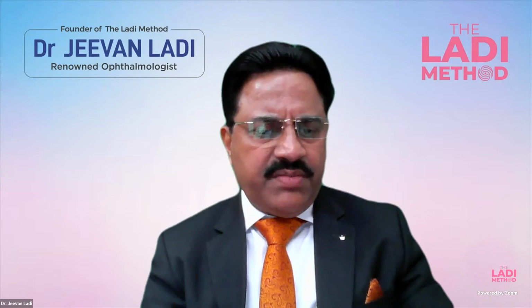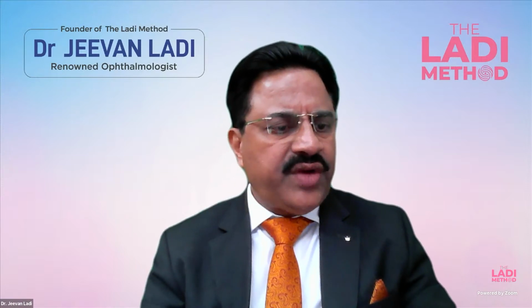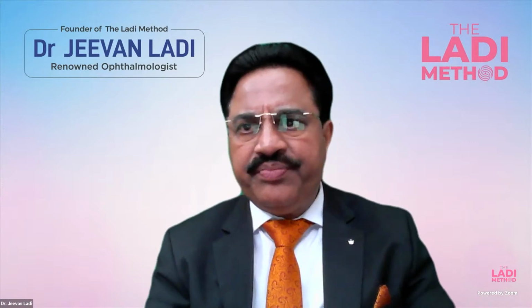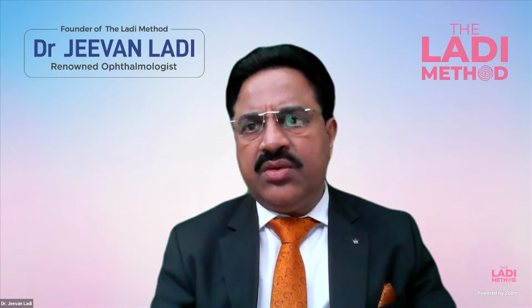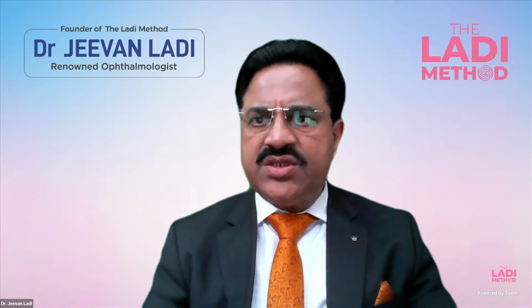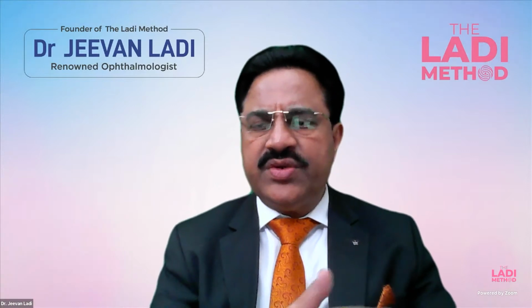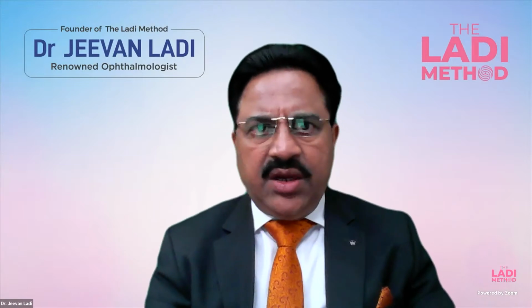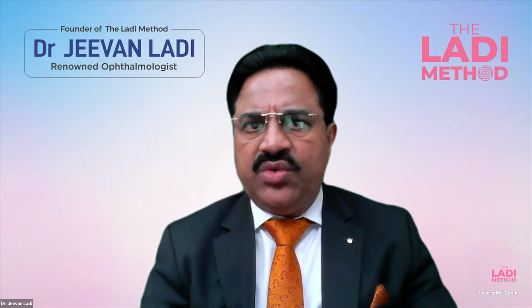Dr. Shrikant Vaidya from Maharashtra is asking this question: how was residual refraction calculated in a fraction less than 0.25? As we have said, visual acuity was converted to logMAR, and post-operatively, whenever we take the readings, our auto settings are set below 0.25. So it starts from 0.1, and then we do the manifest refraction. You can get it on your machines also. If you set your auto refractometer to a value less than 0.25, you can get it.